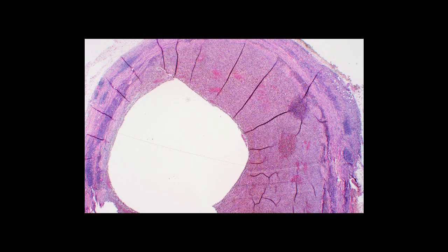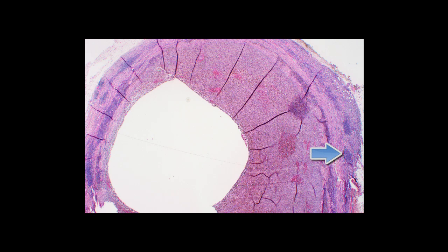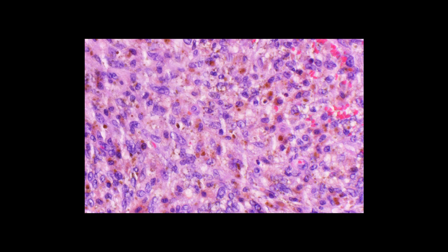Now let me show you two additional examples. Here from low power you can again see the three features: a central cystic space, although the blood is largely washed out of this one; surrounding sheets of histiocytoid tumor cells; and a peripheral lymphocytic cuff, though the pseudocapsule is not quite as pronounced. At high power, these are relatively benign-appearing tumor cells with oval-round nuclei and very vesicular chromatin that really look a lot like histiocytes.